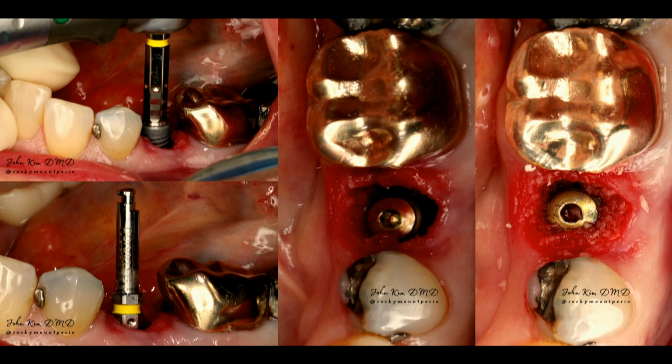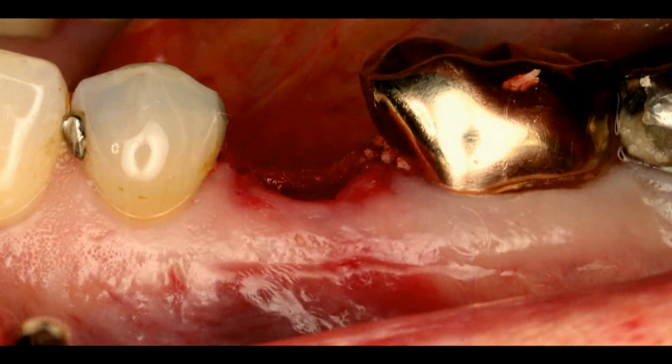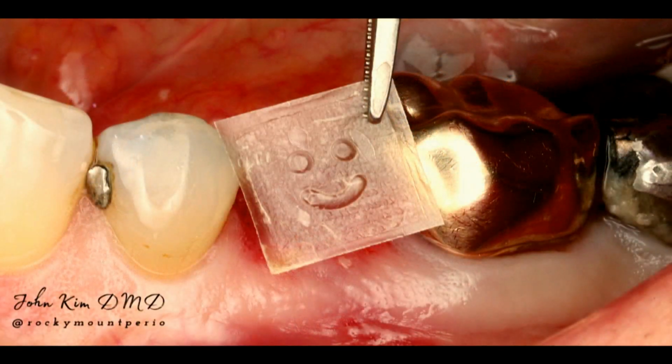I'm going to shift gears a little bit to what we do a lot of in our private practice. Immediacy is the key. I do not know many people out there who want to have 2 surgeries instead of 1. And so immediate implants is a big part of our practice. Again, take the tooth out in a flapless manner, put the implant in the desired restorable position. I graft the gap, and here it is with a lateral view.